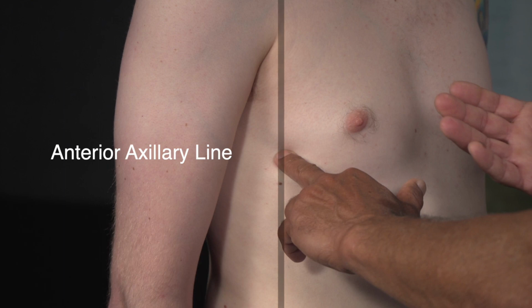And so the preferred location from this point forward is going to be the anterior axillary line in the fourth or fifth intercostal space. That is going to be your first place that you're going to attempt to place a needle in the event that you encounter a tension pneumothorax. Let's talk a little bit about what a tension pneumothorax is.